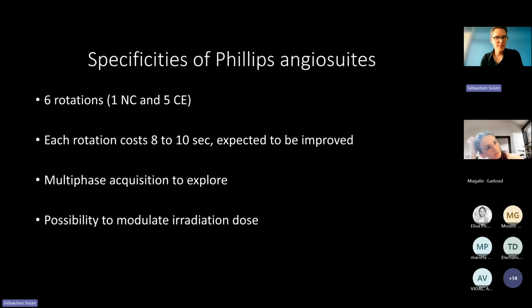We are still waiting for some improvements. What you have to be aware of, even in Siemens, because you can say to me, why don't we do 2 or 3 seconds rotation acquisition so we can have like 20, 30 time points? But you don't have the same machine. You don't have the same tube, the same cooling of the tube also, the same angle of acquisition.